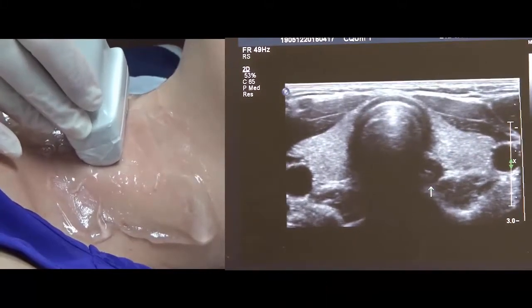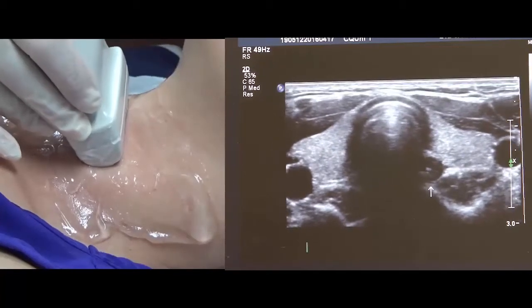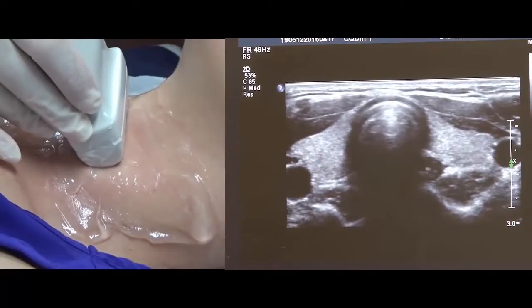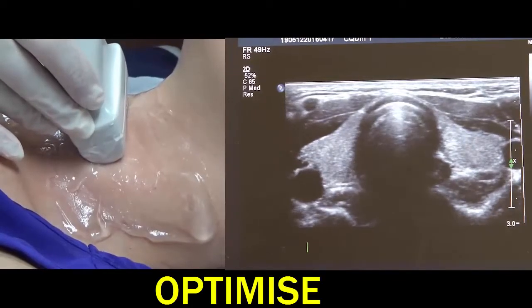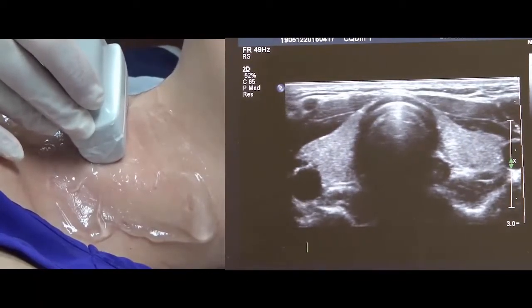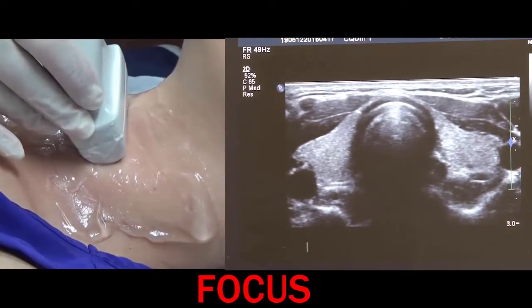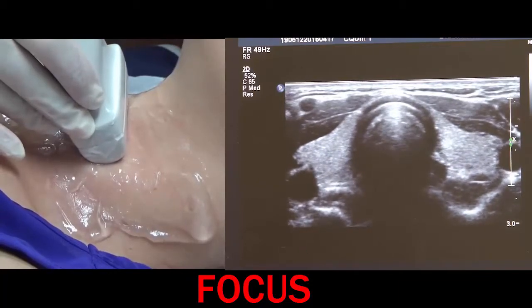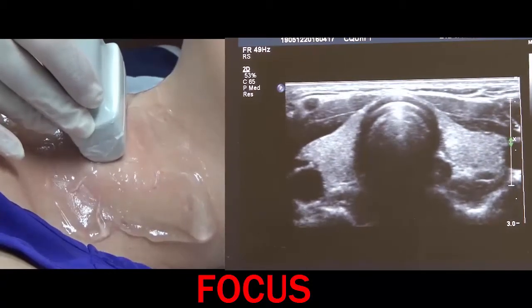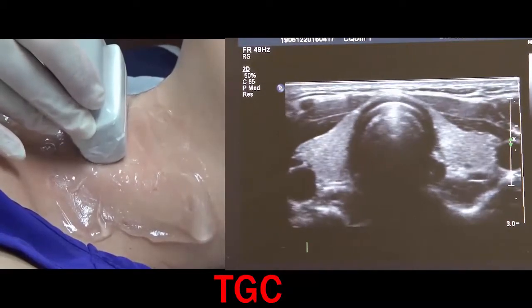If you do have a thyroid that's a little bit larger, you might need to use wide scan. However, in this instance, we're not going to. We try not to do that because it does degrade the image. So let's do the O for optimizing. We're going to do depth, which is fine. Focus a little bit up there, keeping in mind that we need that posterior section for resolution, and TGC, we want it a little bit darker there in that anterior aspect.